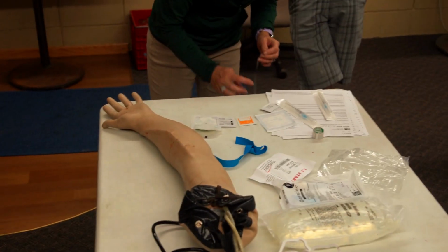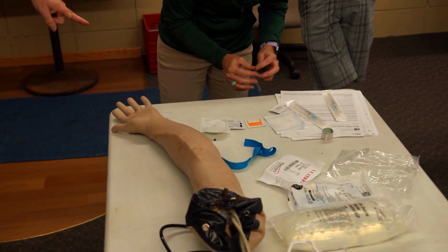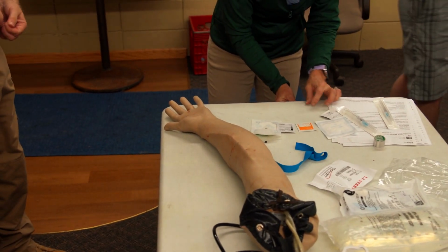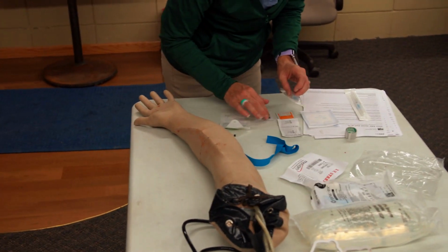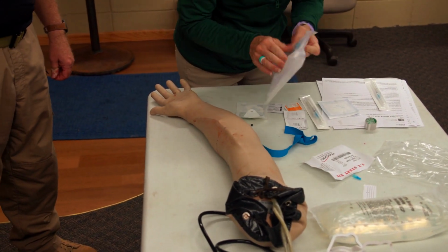So if I'm doing without Tegaderm, then I'll do 4 of those. Oh, okay. Sure. I'll show you, there's a little butterfly technique I use if I don't have a Tegaderm. I feel like that's what they do when we donate blood. They could be. You don't want the whole setup because it's coming off.